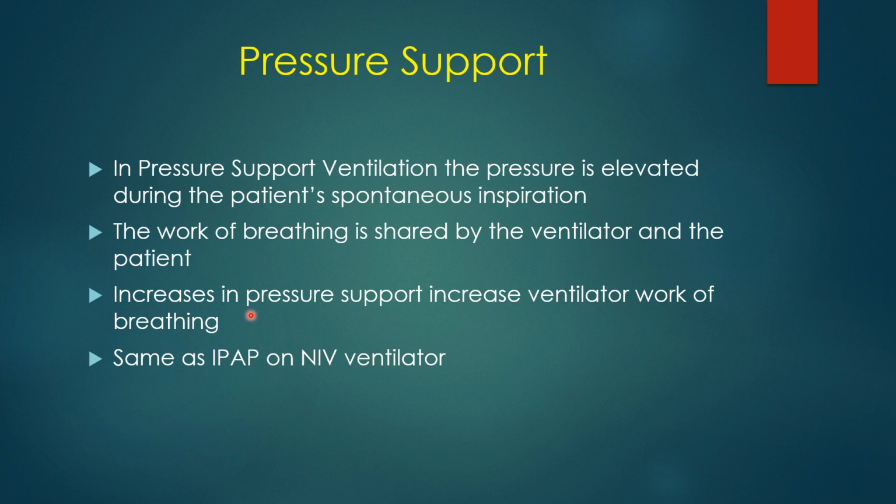No matter what mode or breath type we're using for our patient on the ventilator, one of our goals should be to make the patient comfortable. Having the patient have an increase in work of breathing is not of benefit to the patient. I know in the past sometimes doctors would want to work the patient out. So we'd do these things called wind sprints. We'd take them off the ventilator and they'd chug away for a little while as long as they had tolerated it. And they thought that they were building up the patient's respiratory muscles, which turned out not to be true at all. What we were doing was we were fatiguing their respiratory muscles.